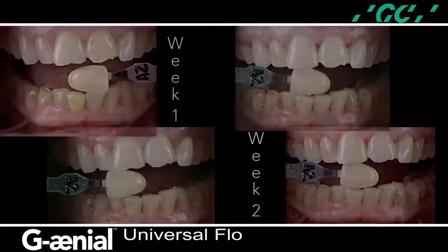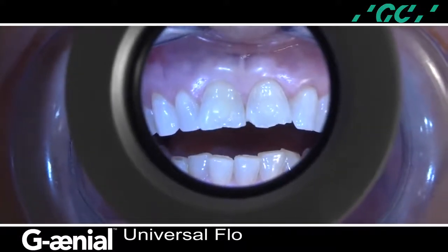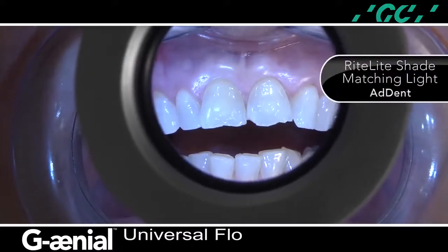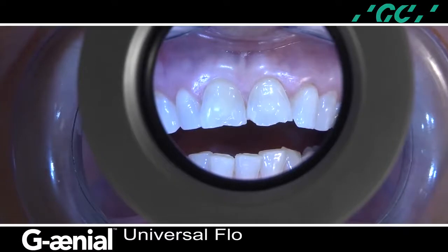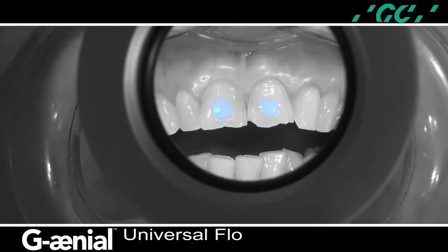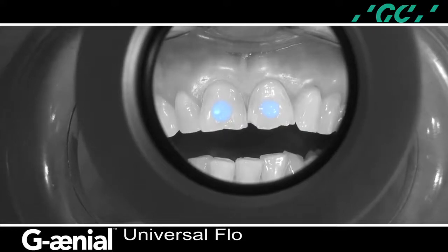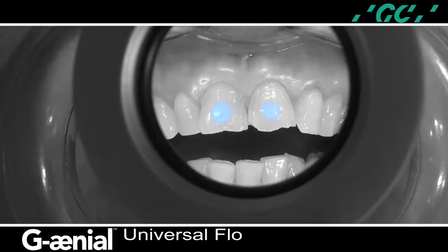A restorative shade determination was performed before dental dam placement under a color-corrected daylight source of 5500 Kelvin using the Right-Light shade-matching light by ADDENT. Color comparison was performed by direct composite placement of an A1 and B1 shaded flowable composite, Genial Universal Flow, polymerized onto the facial surface of the central incisors. This allows us to achieve proper color registration.